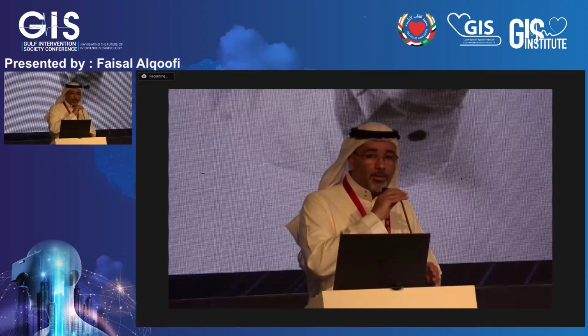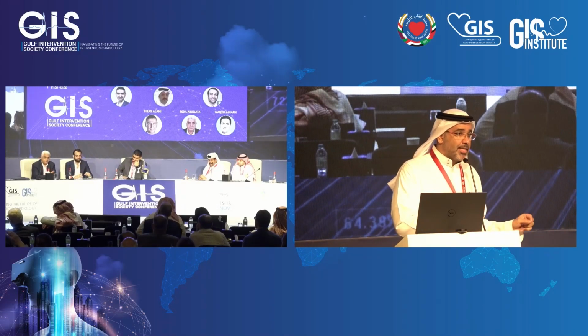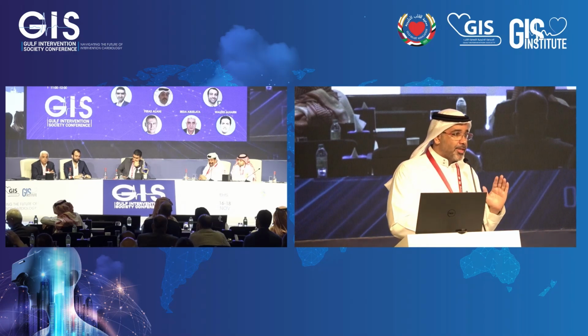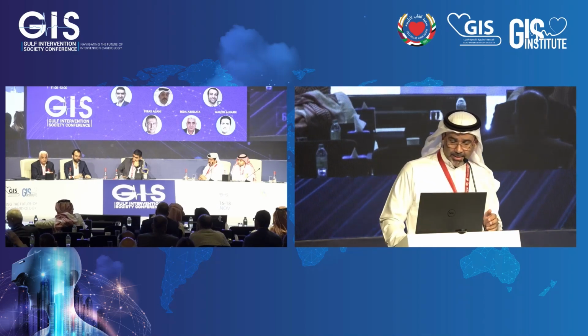So I was planning to read my conclusion, but I can tell you for the time being, we are doing TAVI with low calcium, most likely in women. Pay attention to the sizing. As for the platform currently, there is no special platform better than the other, with the exception of the JenaValve that is currently being used for pure AI.